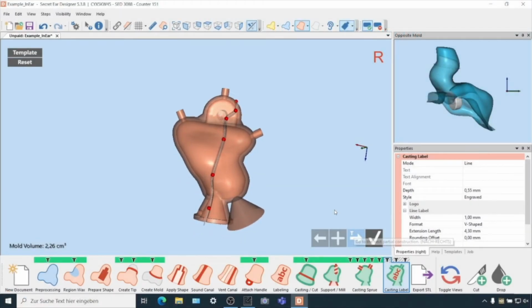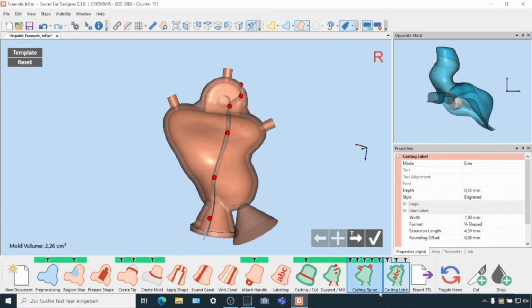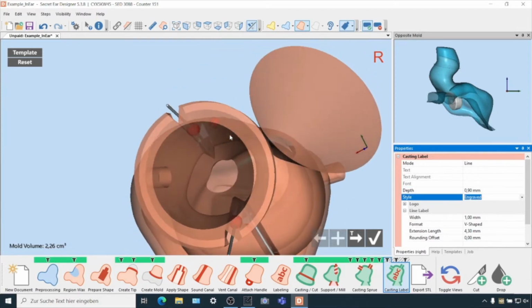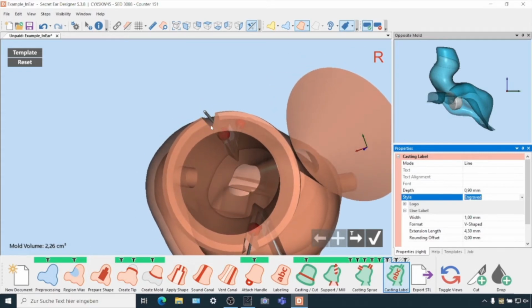So the last step here is to set the crush line. It is here on the casting label. Now the mode is selected line. You can see here on the right side, we need 0.9 millimeters to go inside. The style is engraved, for sure. So that means here we have the wall thickness. Now we can see this is a V line like this one here. The wall thickness is 1 millimeter, and we go 0.9 millimeters inside of the wall.